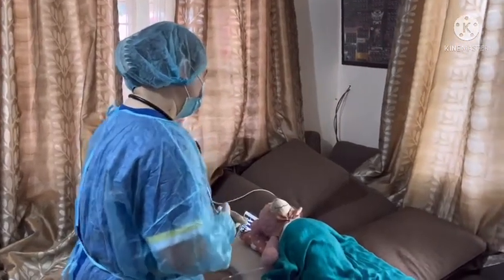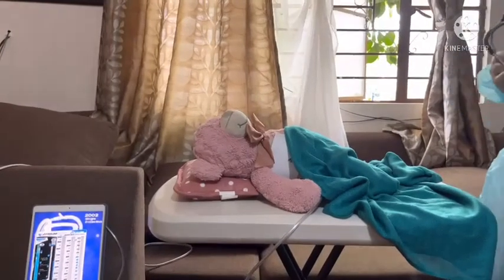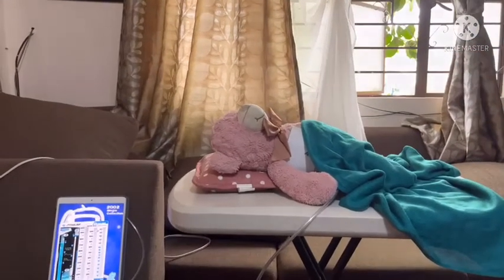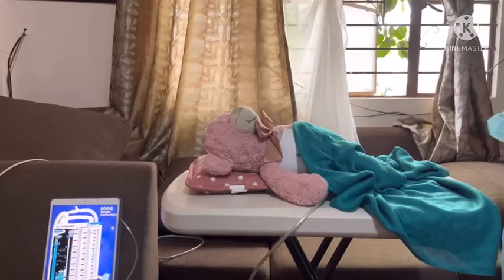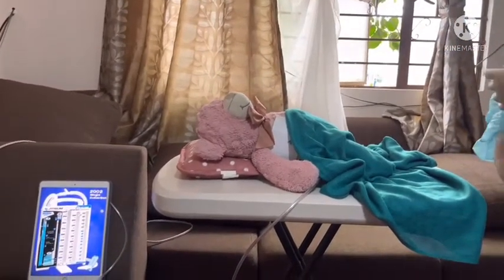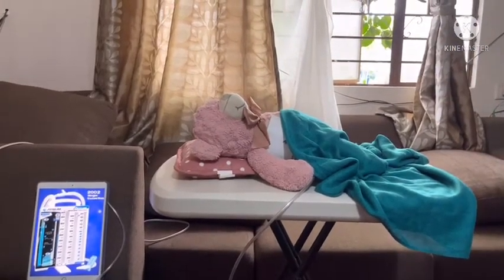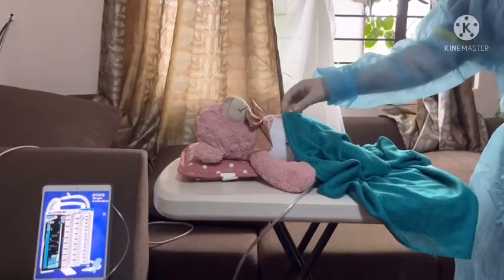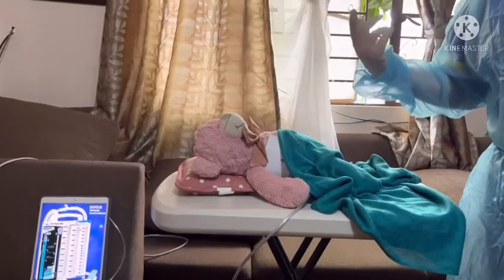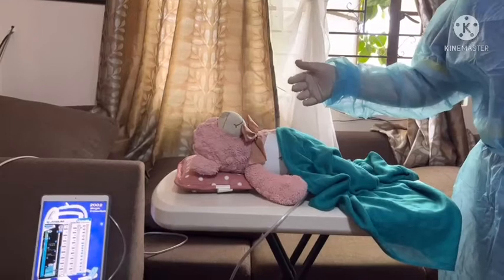So let's start. Hello, ma'am. Are you having any pain right now? Okay, now I'm just going to check your chest tube and your lung sounds. Before we pull the cover of the patient, make sure that we provide privacy and also get the consent.